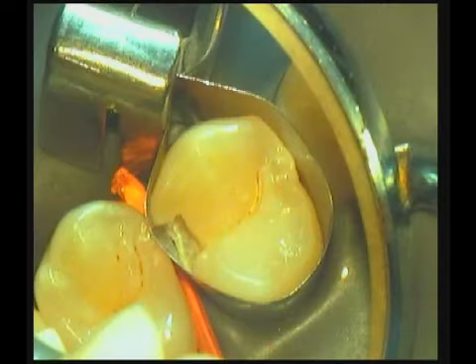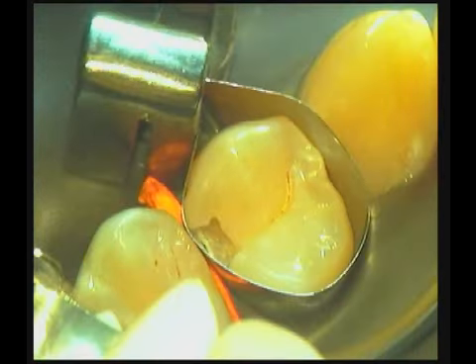Now I'm going to use the back of a spoon excavator to burnish that matrix and to give it a bit of contour and to make sure that I can feel the adjacent tooth through the matrix.